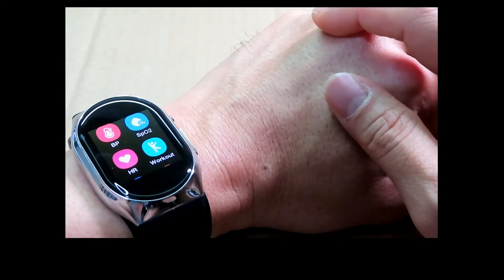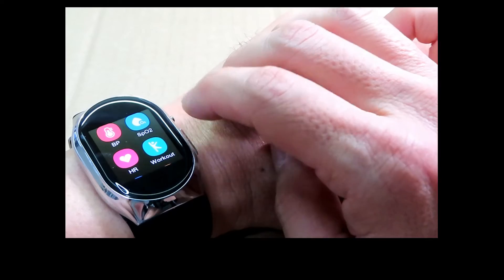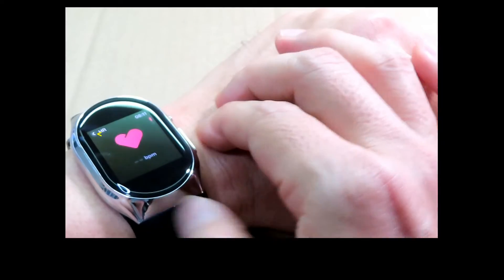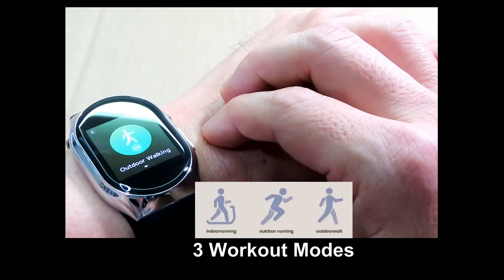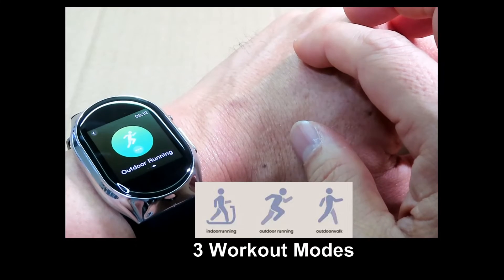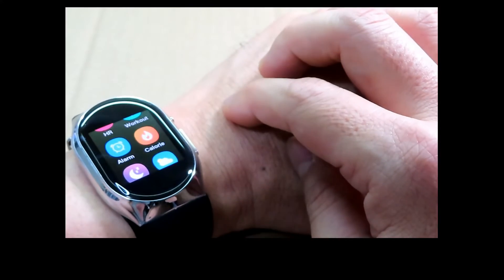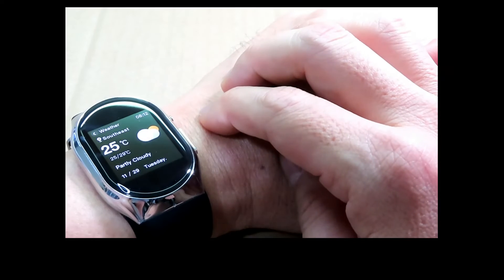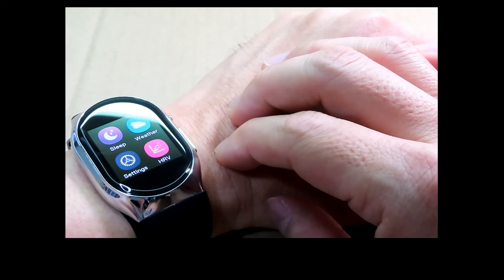The watch has BP measurement, which we'll show in a while. It also measures SpO2 oxygen saturation and heart rate. For workout modes, you have outdoor walking, indoor running on a treadmill, and outdoor running. You can set alarms, it does calorie counting, measures sleep, and the weather is synchronized with the app. It also has a heart rate variability test measured during rest.